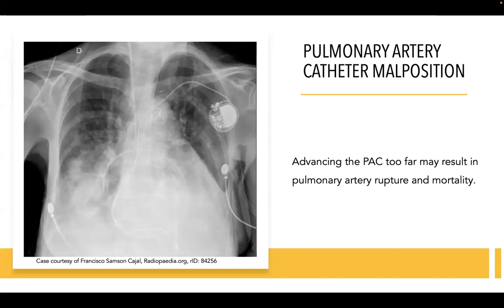and coronary artery bypass graft who presented to the emergency department with acute dyspnea. The patient required placement of a pulmonary artery catheter and was diagnosed with pulmonary hypertension. Shortly after placement of the pulmonary artery catheter, the patient began coughing up blood.